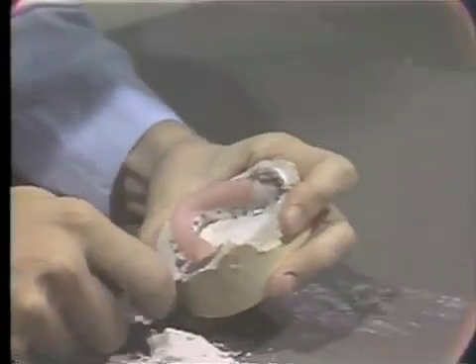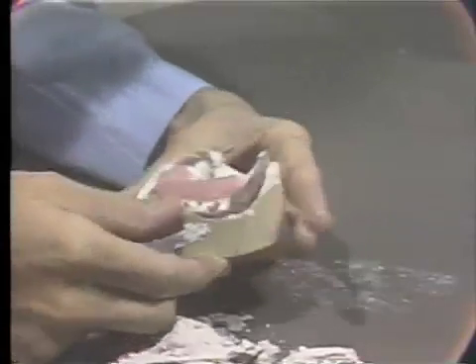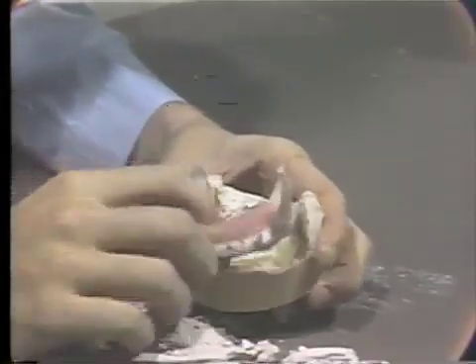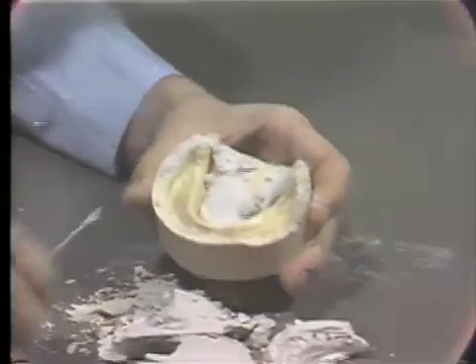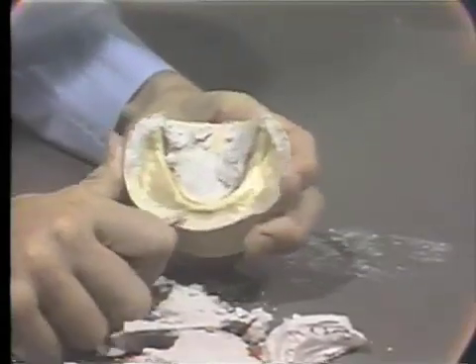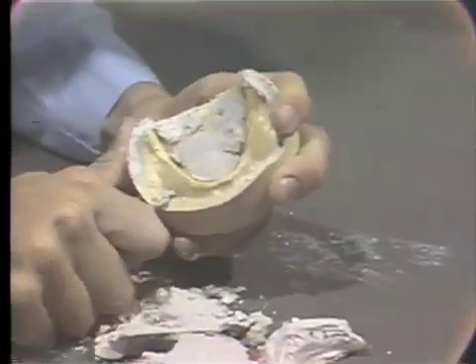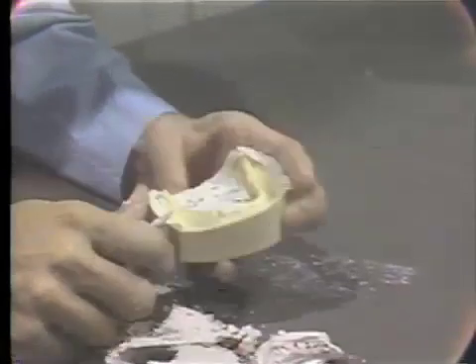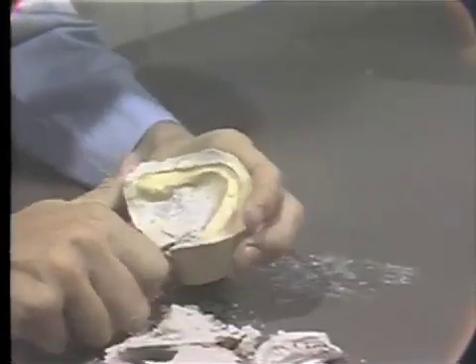The final removal of the impression is done by carefully teasing the knife blade at the edge of the impression in the stone model and separating in this manner. Going back with the laboratory knife, we can dress up the landing area on our master cast in preparation for the final trimming of these casts on the model trimmer.